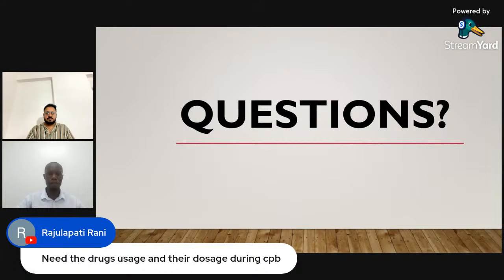Okay, so I would like to ask you a question. Do you add any drugs in the priming solution? Yeah, we do. The drugs that we add in the prime include the sodium bicarbonate. How much do you add for pediatrics? For pediatrics, I add 10 mils.